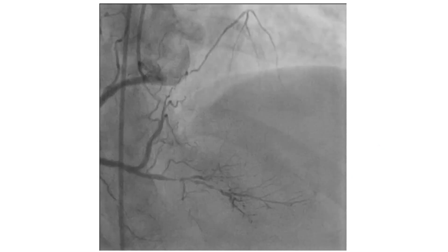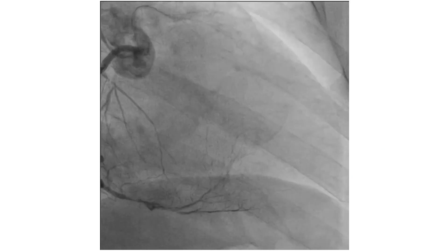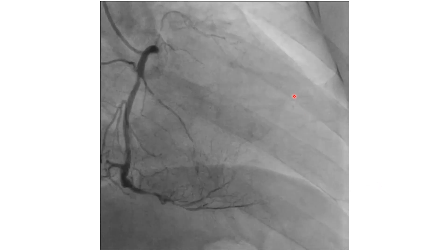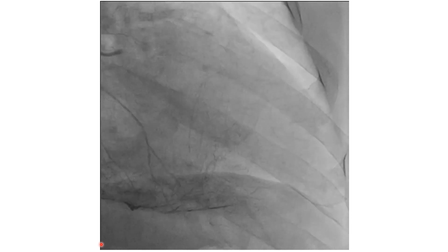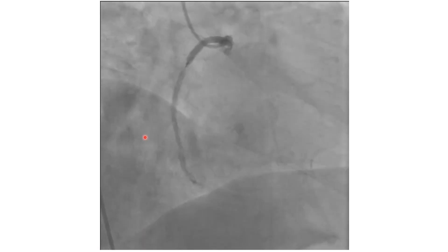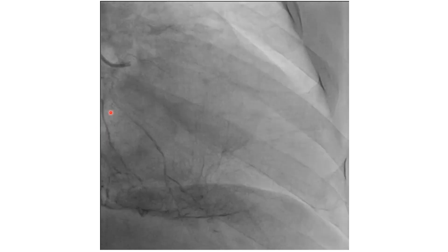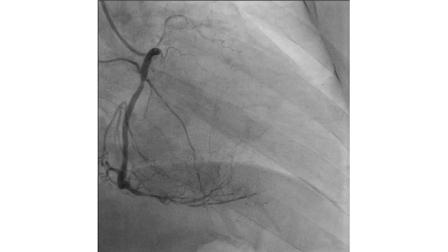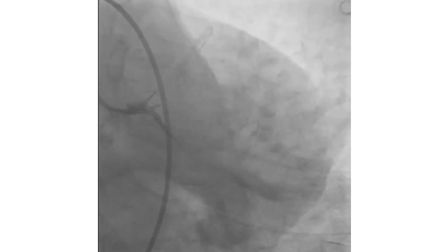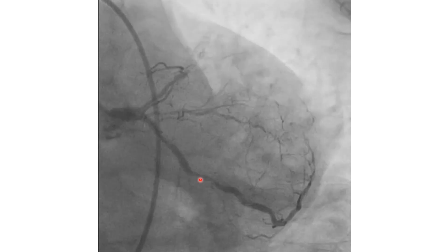So we need another view. This is the RAO view. Usually in this view, the LAD course would be here in a retrograde flow, but we cannot see it. Actually, the retrograde vessel seen in the cranial view is passing here, and it seems to be related to the left circumflex because it is passing in the AV groove. Reassessing the left injection, we can realize that the circumflex is actually having a total occlusion here.